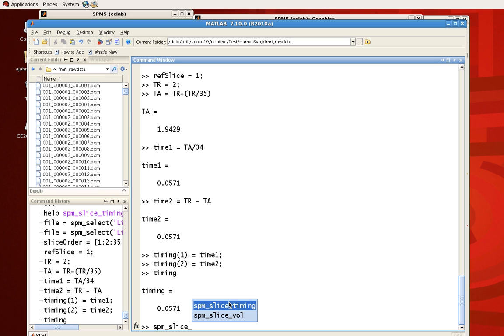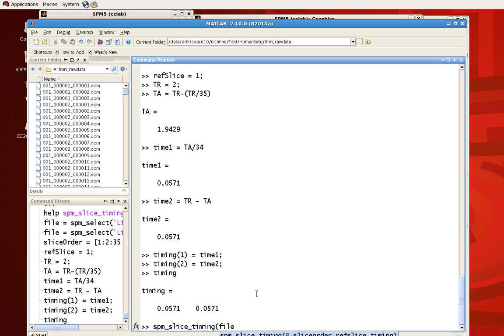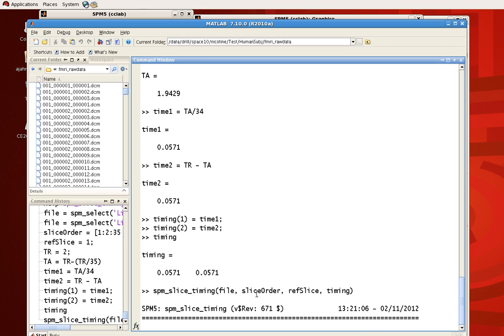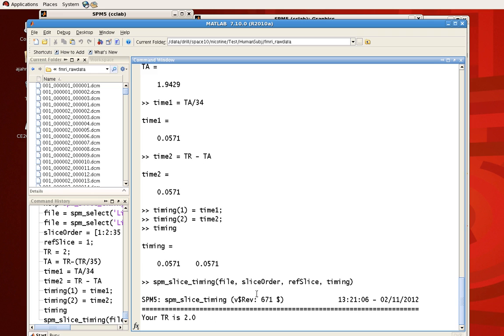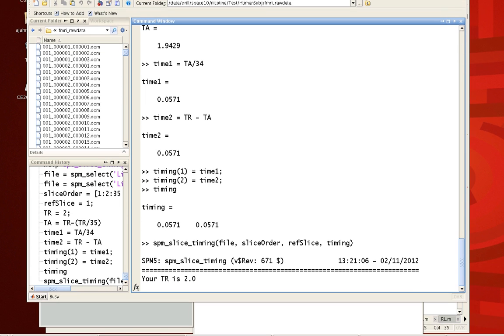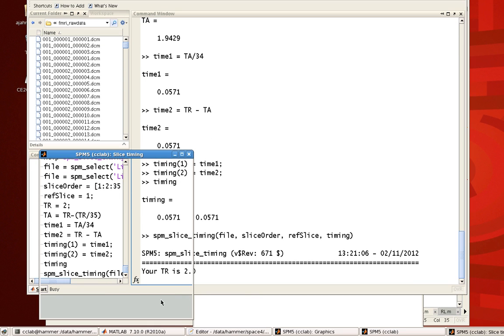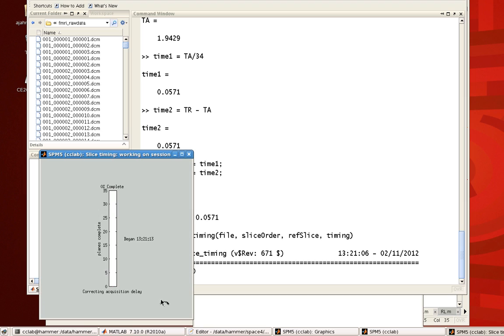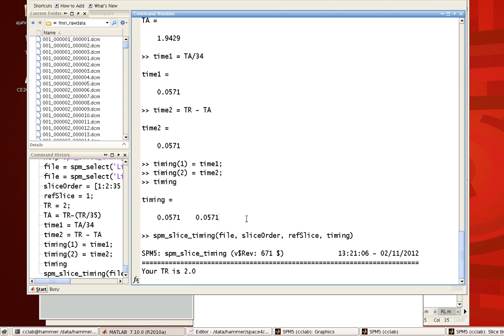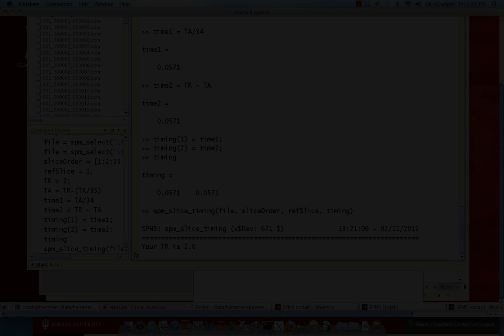And now we can go ahead, call upon the spm_slice_timing command, and give it the necessary arguments. So file, slice order, ref slice, and timing. And so there it goes. Just like I did before, you'll get a progress bar in the bottom left screen. Just like we did before, we don't need to wait for it to complete. But that's how you do slice timing correction in SPM from the command line.